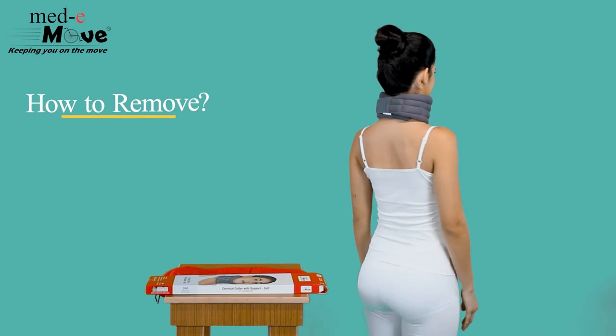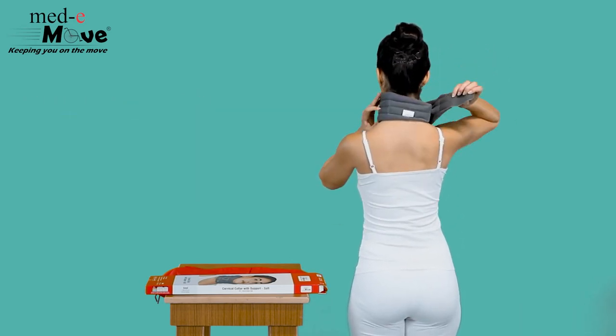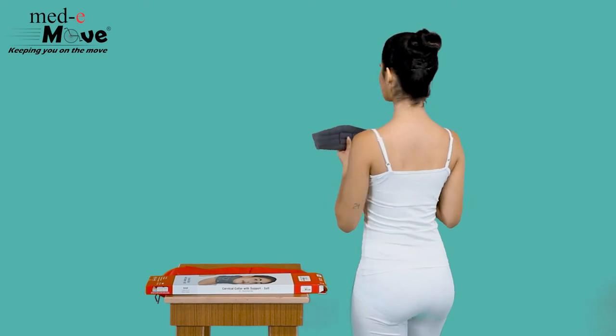Now let us see how to remove the Medimove soft collar with support. Simply unfasten both the hook and loop closures enabling easy removal.